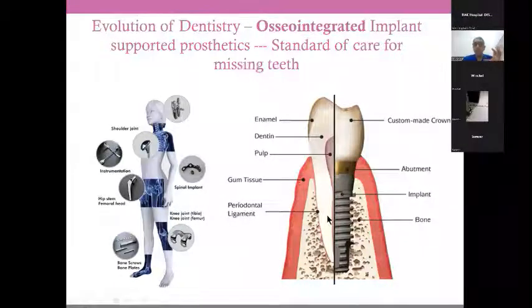Now, the beauty of these dental implants is that they have very special surface coatings. They are quite rough. They are special coatings, and the material titanium per se attracts bone cells to grow into them. So not only is it a mechanical screw which is engaging in the bone physically, but also biologically, the bone grows into this special surface over the implant, and that's why we call them osseo-integrated. Osseous refers to bone. Integration means it's a biological integration, and that's why this modality over a period of time is a very, very well-established clinical technique which has found great success.